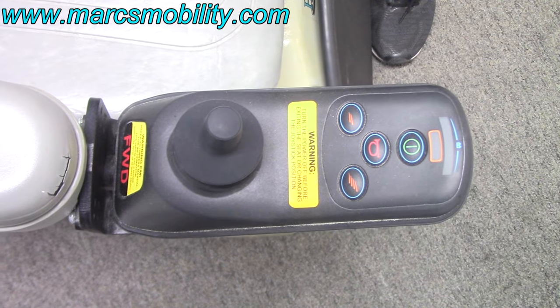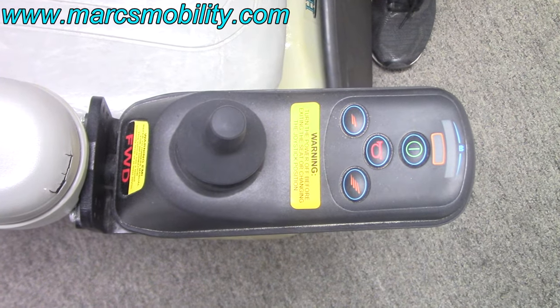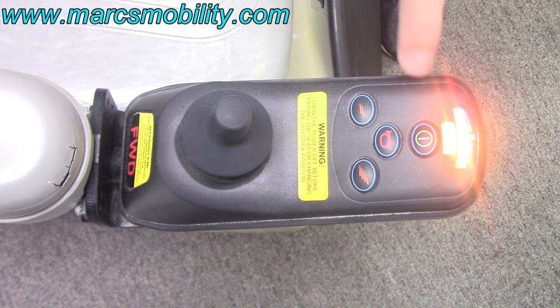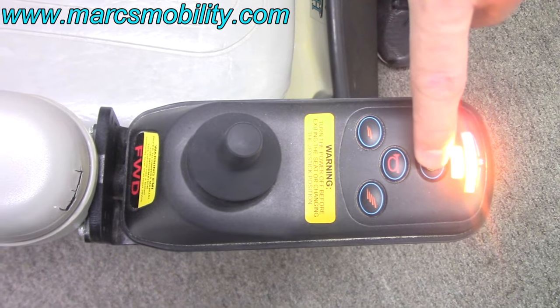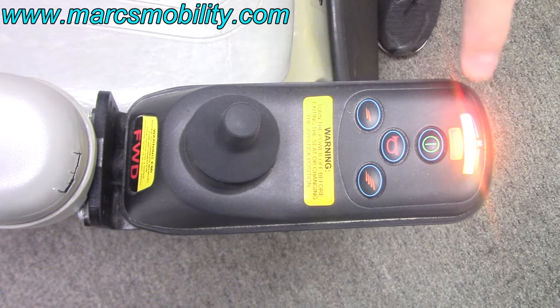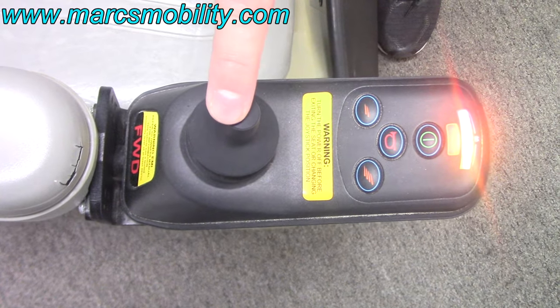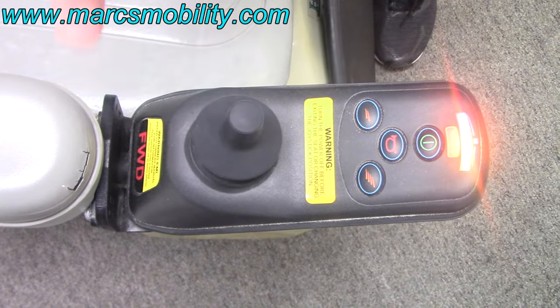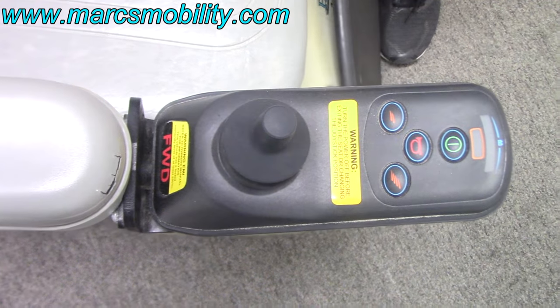The first thing I will show you is how to lock and unlock the joystick. When your power is on, you're going to hold the power button down for one to two seconds until you hear it beep. Once it beeps, you push the joystick forward till it beeps, then hold it in reverse till it beeps, and then it makes a loud beep and turns off.